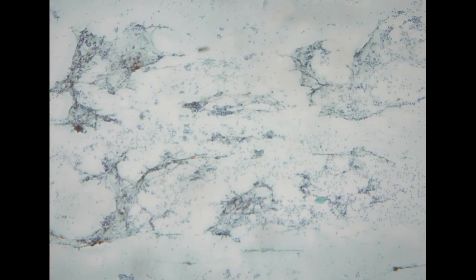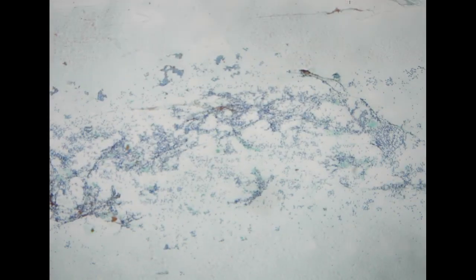So this is the direct smear of this case. So for this preparation, it's more obvious because on low power, you can already appreciate that there is like a fibrovascular meshwork forming these papillary architecture, and lining cell seems quite often falling down from these meshwork.